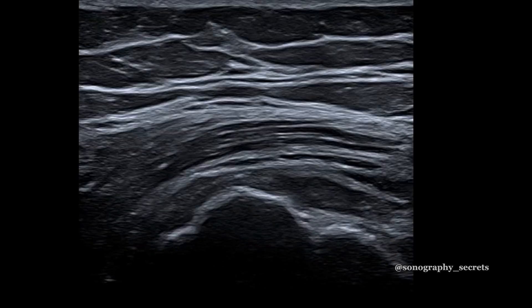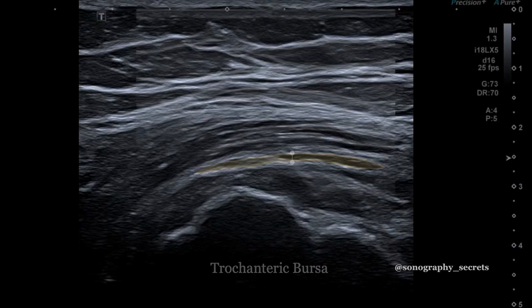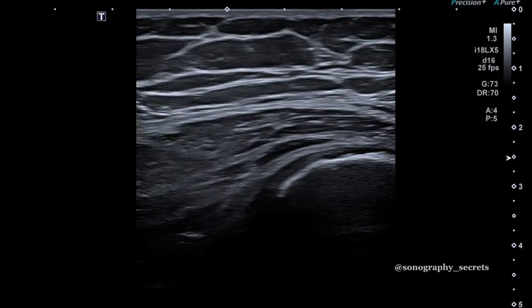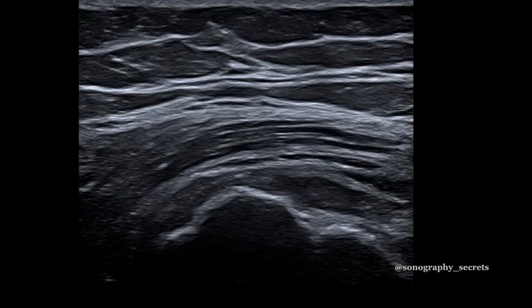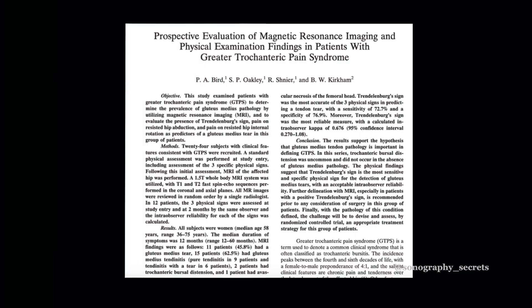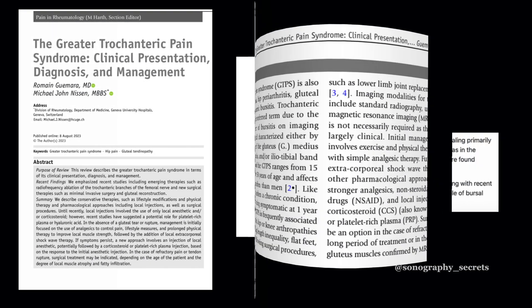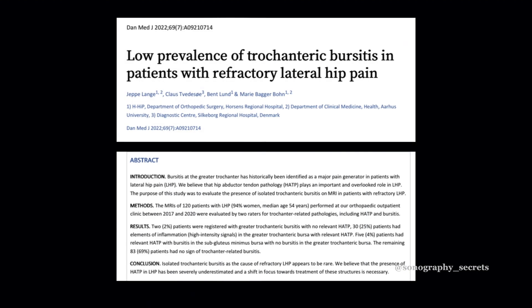The last pitfall is incorrectly identifying the trochanteric bursa. Whatever you do, don't measure this and call it a thickened, fluid-filled trochanteric bursa. It's not. This is simply the muscle of glute med. Don't believe me? Read any paper over the past 20 years and they'll all essentially conclude the same.